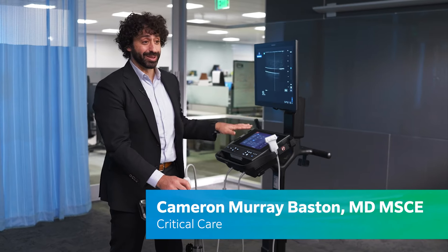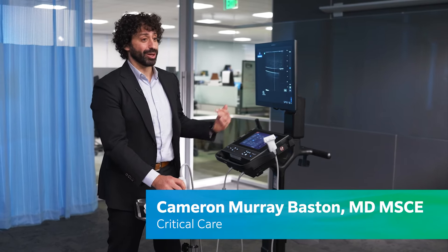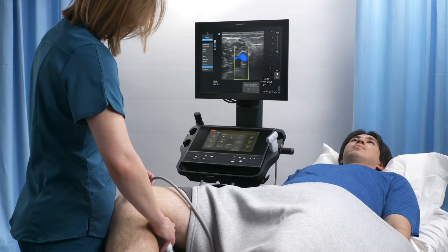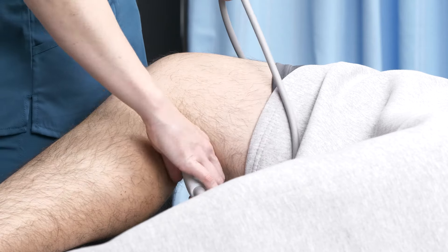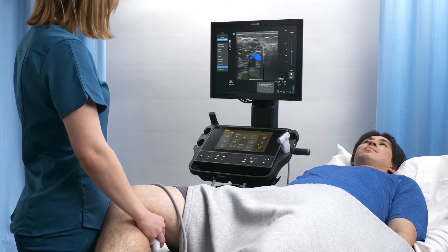I've got a ventilator, I've got a dialysis unit, sometimes I have an ECMO machine, and trying to figure out where I put this — it's the last thing in the room, so it's going wherever there's space for it. This could be further away and you could still have pretty good control, so that way you get more access to the patient and still have total control of your ultrasound.